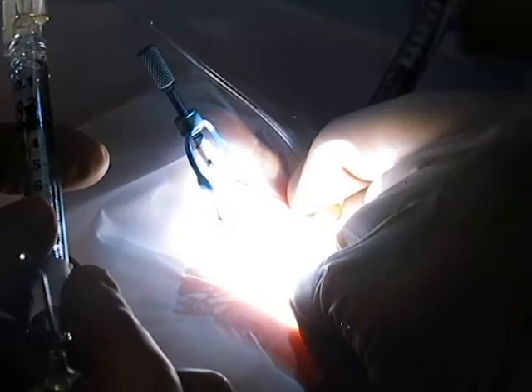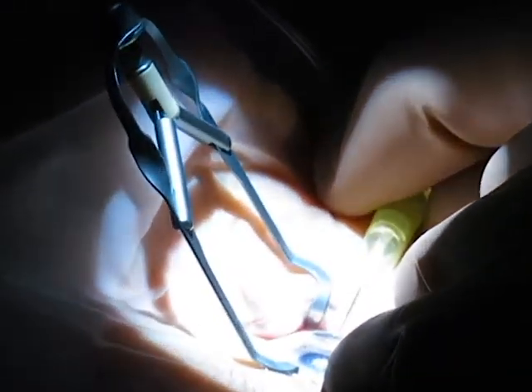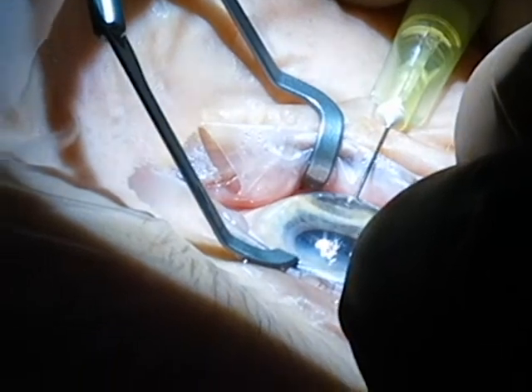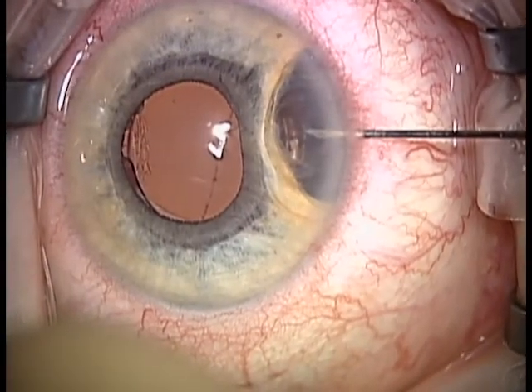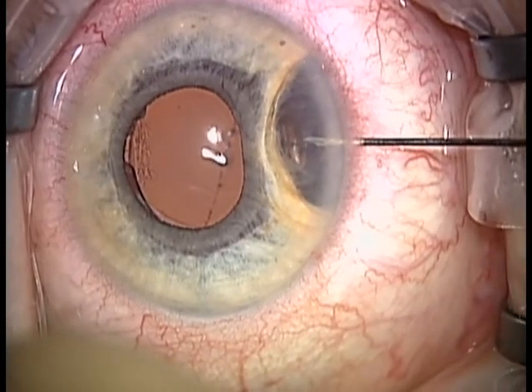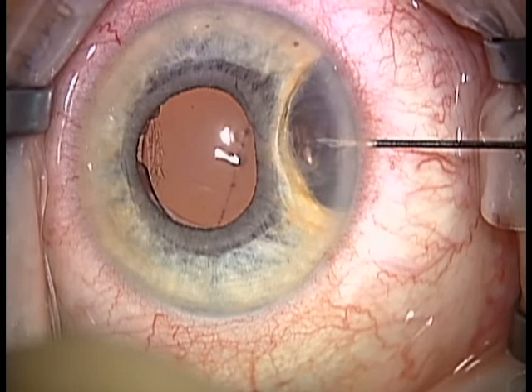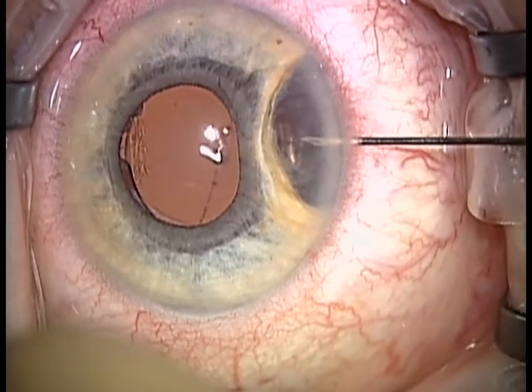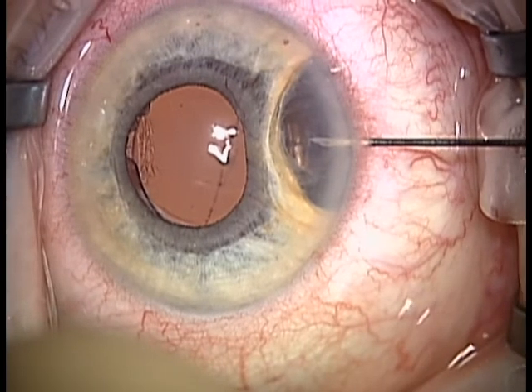It's important to have good anesthesia so the patient doesn't move, and I have firmly fixated my hand steadying the needle to the patient's orbital rim. The ethanol is then left in position for about 30 seconds to a minute, and one watches for the wall of the cyst to become frosted and slightly opaque, which indicates that the ethanol is killing the contained epithelial cells.